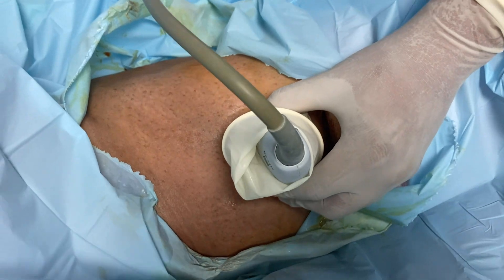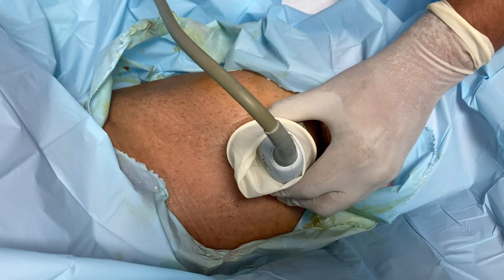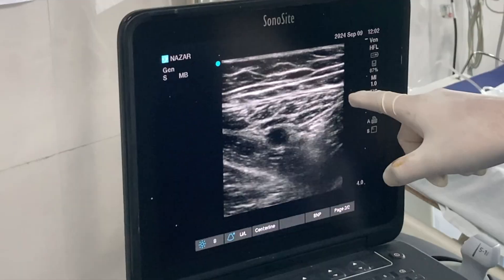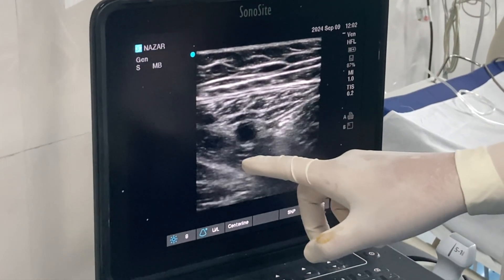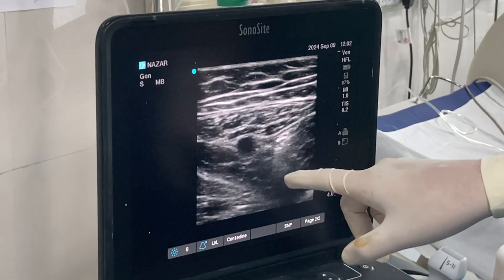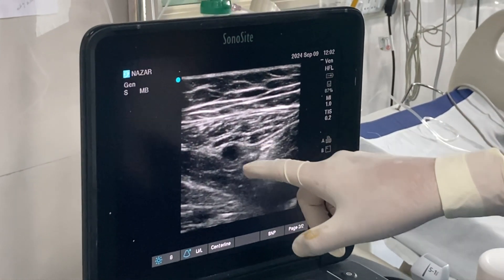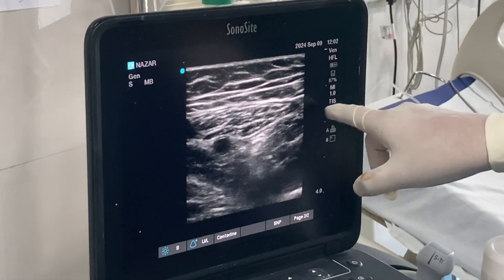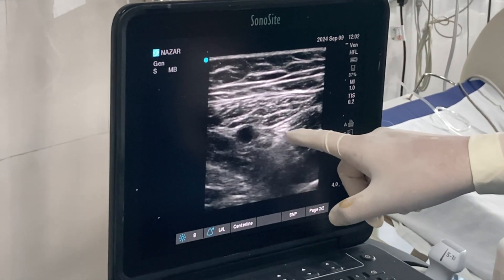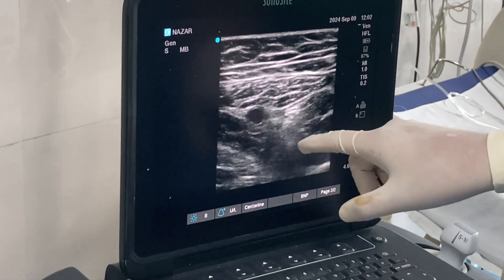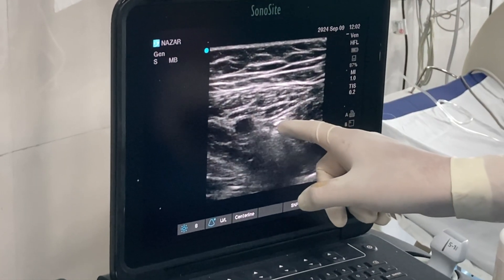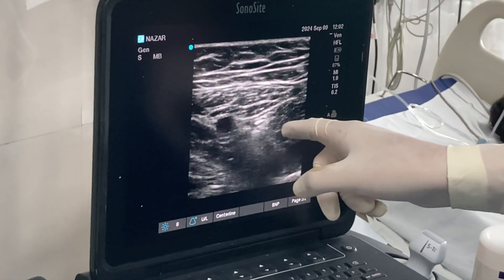I have placed my probe over the medial aspect of the mid-thigh. Here you can see the sartorius muscle making the roof of the adductor canal. On the medial side, this is the adductor longus and adductor magnus. This is the femoral artery, and on the lateral side, this is the vastus medialis muscle. This hyperechoic structure is the saphenous nerve. We have to deposit the drug on the lateral side of the femoral vessel.